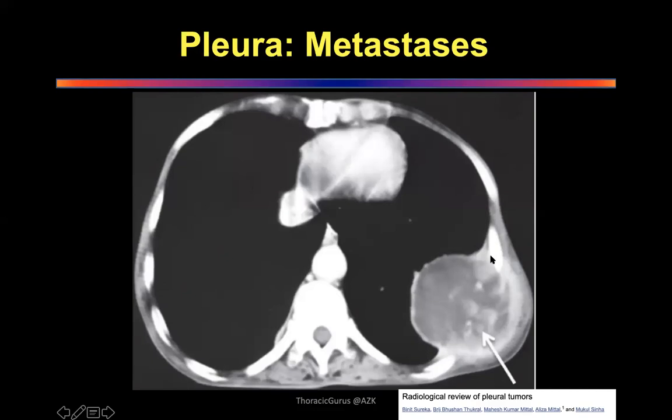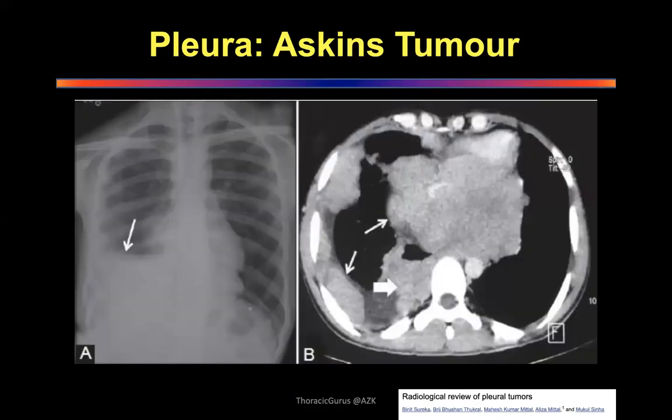Yes, sir. This is less likely to be a primary lung because the ribs are not involved at all. Look at this, the ribs are very clear. If this was any local tumor, it would usually erode the ribs. This is more likely to be a hematogenous spread and it has grown very rapidly. It has not actually involved the ribs. So, all other diagnoses were correct. I have no problem with the differential diagnosis you gave. Don't forget metastasis. That's the point I'm trying to make. Okay? All right. Thank you.